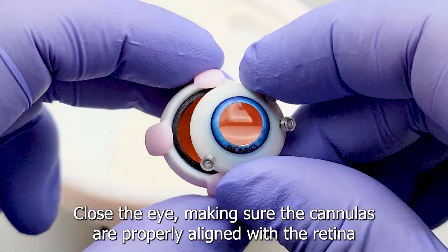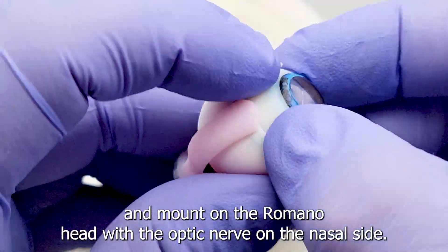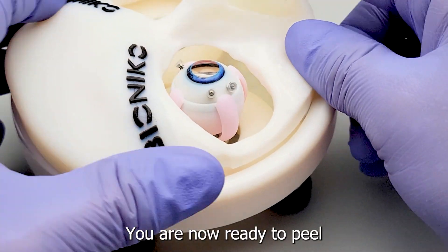Close the eye making sure the cannulas are properly aligned with the retina, and mount on the Romano head with the optic nerve on the nasal side. You are now ready to peel.